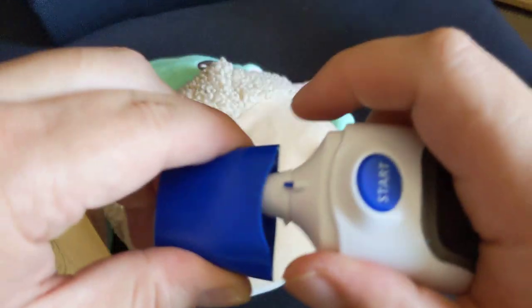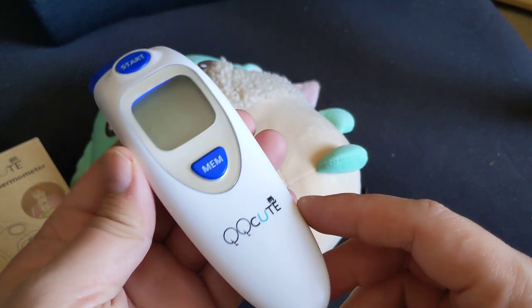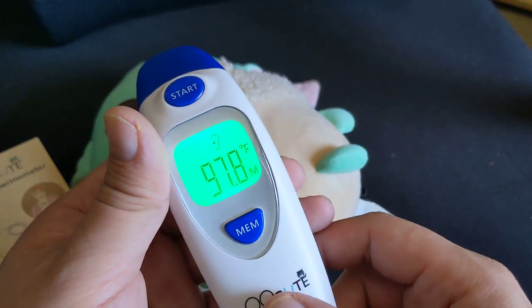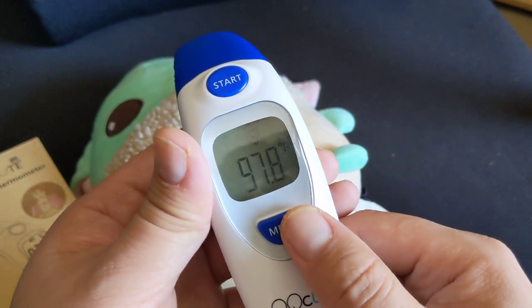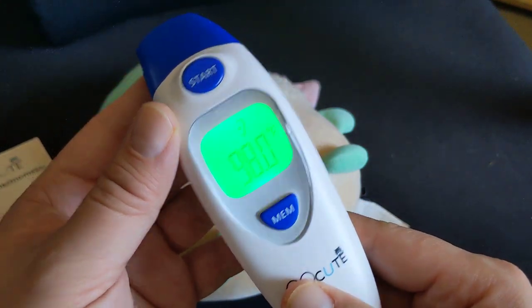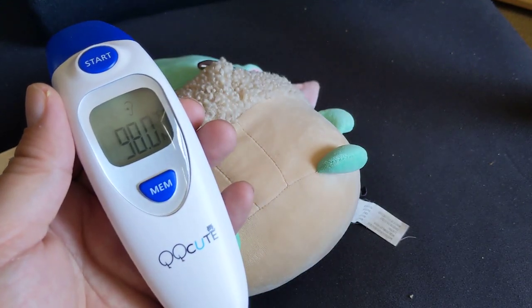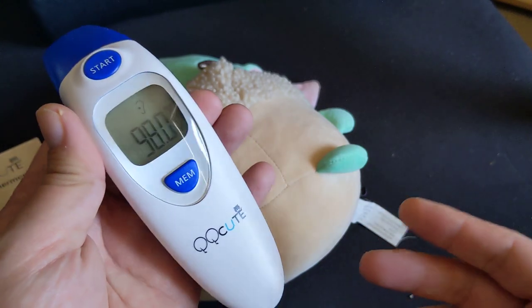It just uses AAA batteries — this pops out if you pull it from the sides. For twelve dollars, obviously I'm not expecting a whole lot. It usually measures below by about half a degree to one degree depending on how you use it. I'm sure there's a way to calibrate it, but it's fine. Just wanted to make this commentary in case you get this and wonder if it's broken — it's not, if it's reading half a degree to one degree lower than usual.